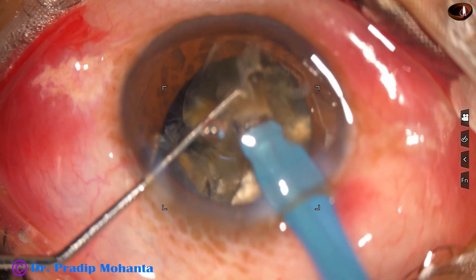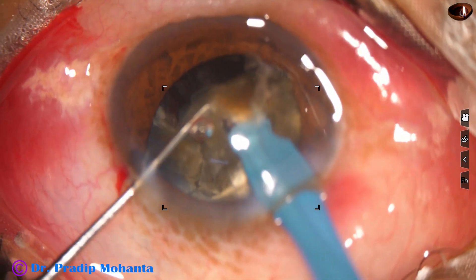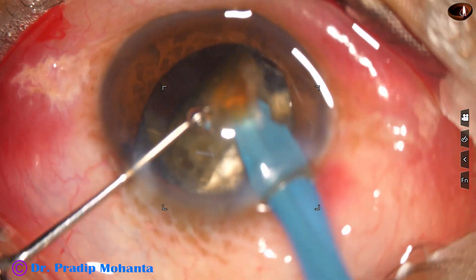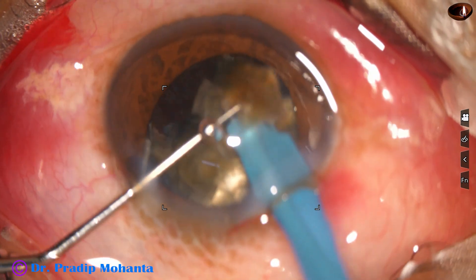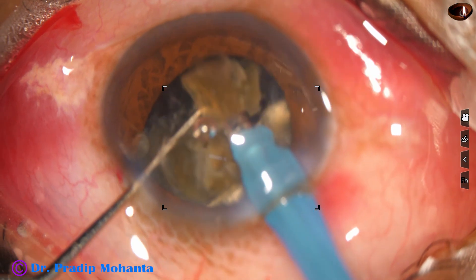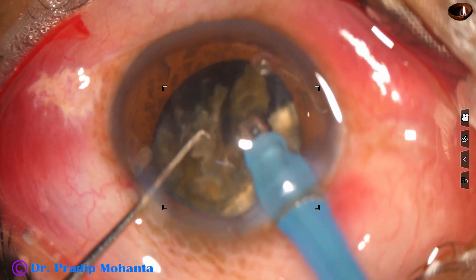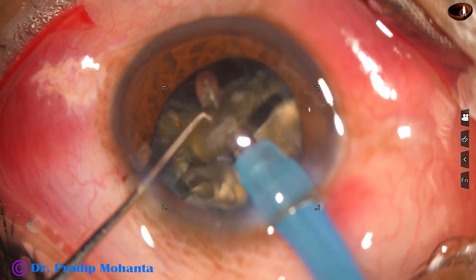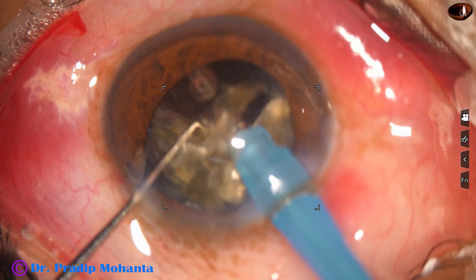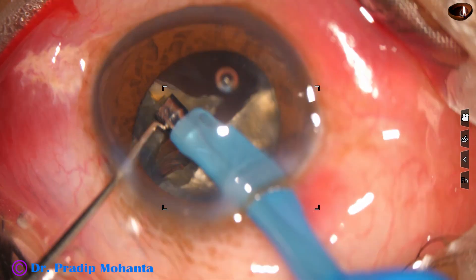There is some kind of floppiness of the iris, though the size of the pupil is adequate. The iris is tending to prolapse through the side port, but the side port is small and it cannot prolapse. So one piece has been removed. Still the last portion of the first quadrant, and now I go to the second piece.